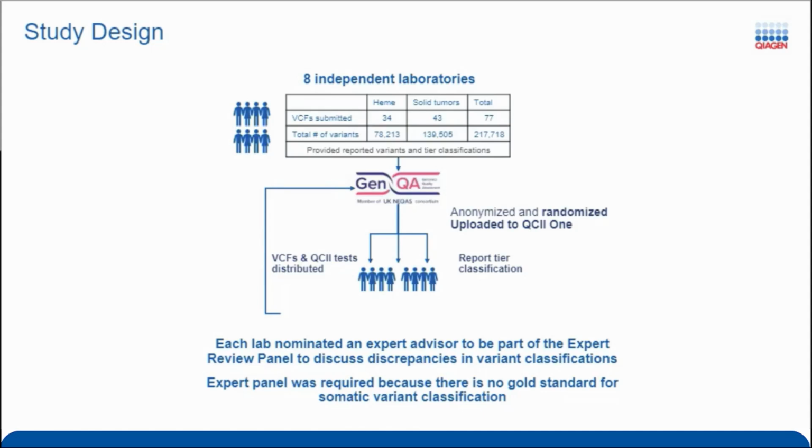So a tier 1A is going to be something that has an approved drug that can be used to target that alteration. A tier 3 is going to be VUS, and tier 2 might be something in clinical trials. Those are really clear-cut delineations that can often be assigned to drug labels and depend on the disease.